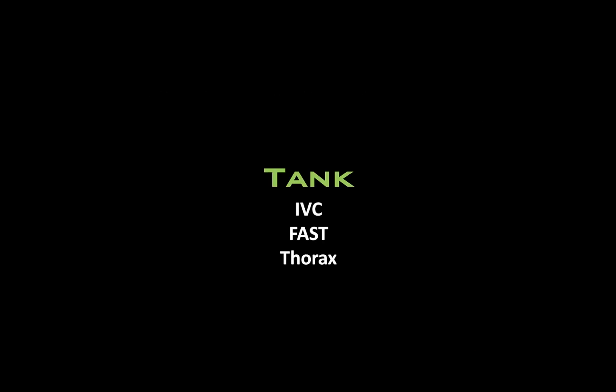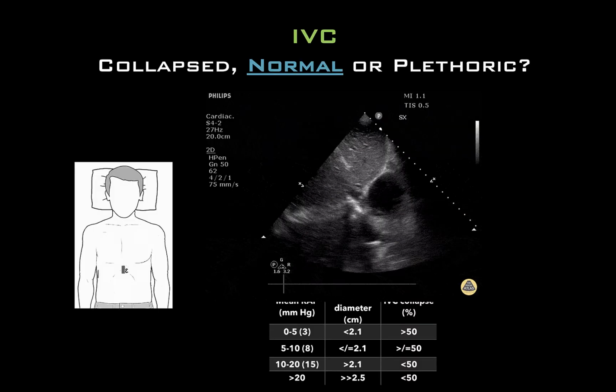The next order of business is to classify the status of the tank, or the intravascular preload component that plays a role in cardiac output. We will start by interrogating the IVC. This will help determine how full the tank is, and can give some information about volume status. The infamous FAST exam will help clarify if the tank is leaking intra-abdominally. And lastly, the thoracic view will help determine if the patient has a pneumothorax, which may have contributing tension physiology.